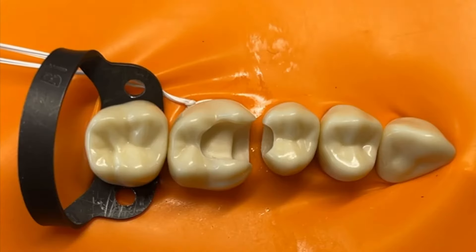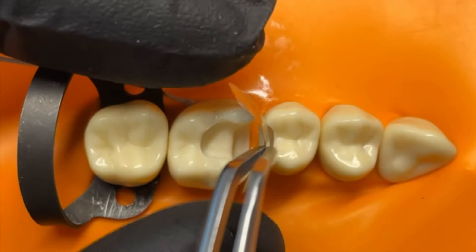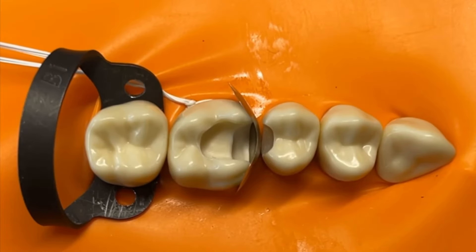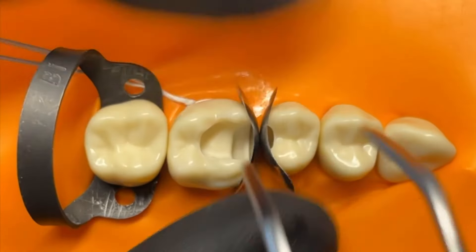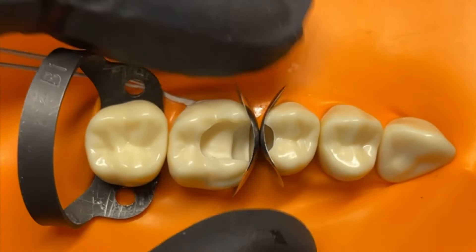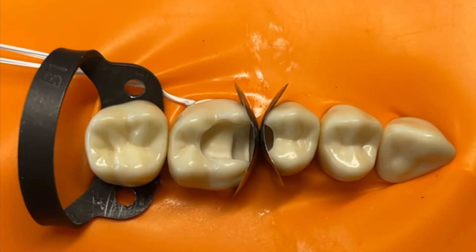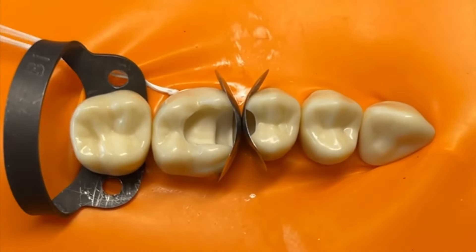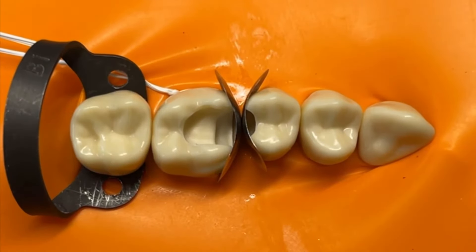A much better way generally is to use two matrix bands at the same time to share the space in a much more controlled way. The key is to look at the bridging space — the gap between the two cavities — and pick your matrix bands accordingly. You really want the bands to touch and share the space well. Here I've used a double-curved Torvian band on the molar and a classic Torvian band on the premolar. When I used two double-curved bands it was too much and we were getting deformation, but this combination was the best, giving a really nice profile.